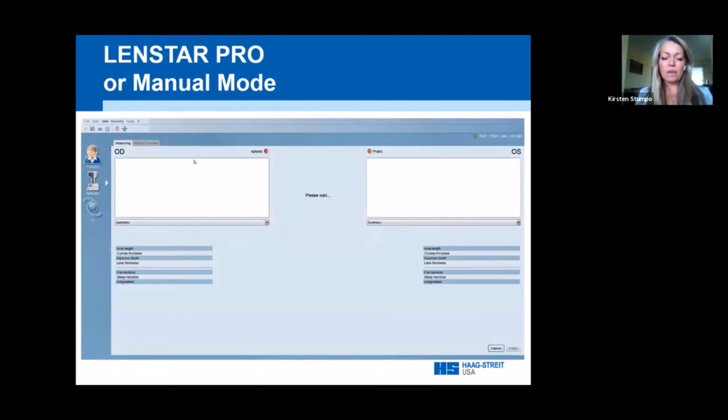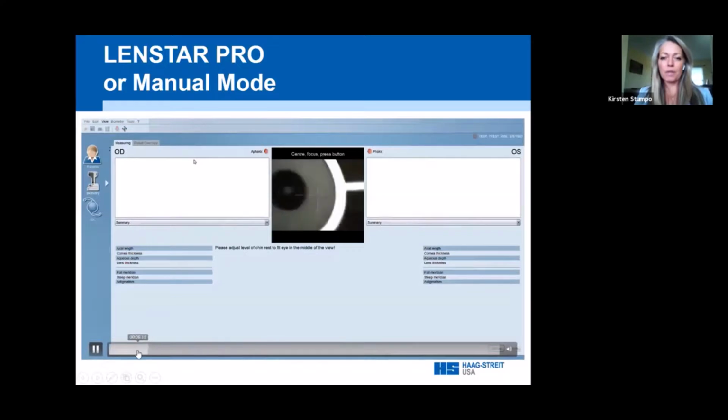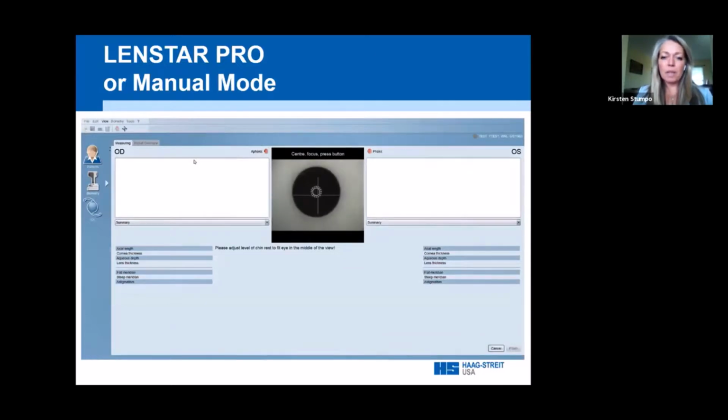Yeah, so that first initial focus alignment is a pretty big movement because you're adjusting your gross focus. After that, once you get those 32 keratometry reflections separated, you click the button and go into a fine focus. So these are very little movements.